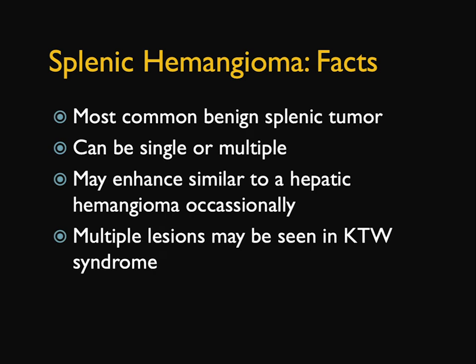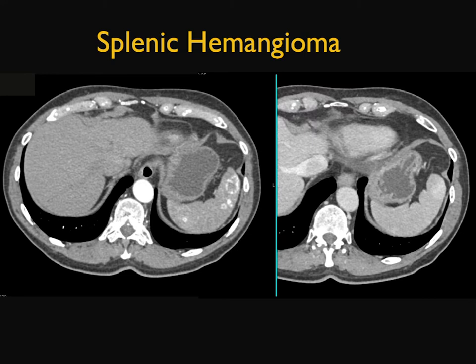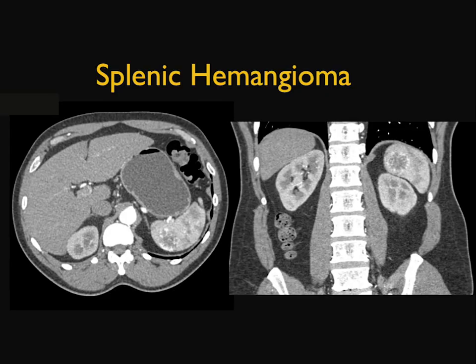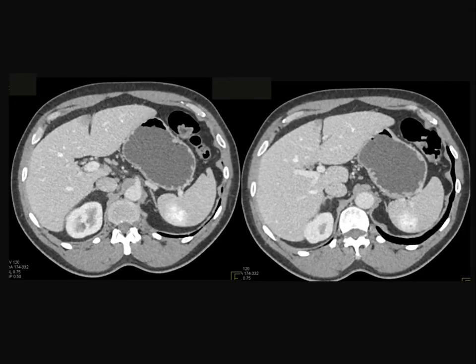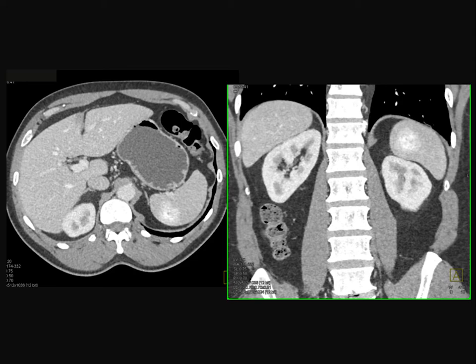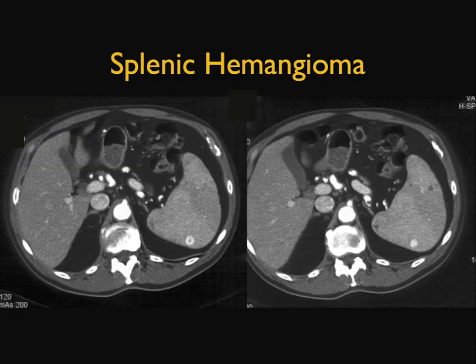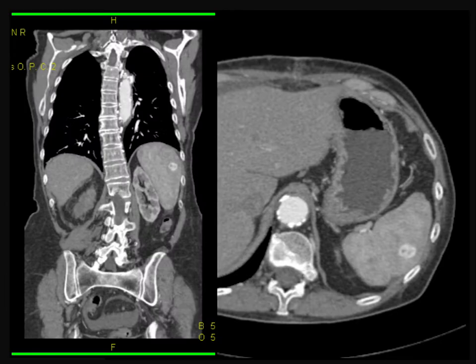Hemangiomas are the most common splenic tumor, and we can see multiple occasionally in a regular patient, but particularly in Klippel-Trenaunay-Weber syndrome. Here are hemangiomas showing multiple peripheral enhancement that fills in over time — very classic for hemangioma. Here's another example: peripheral puddling, and you can see in the next set of images it fills in over time. When you have this appearance, there is nothing really else to think about — it's hemangioma.